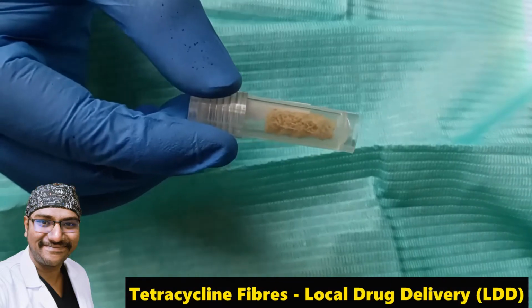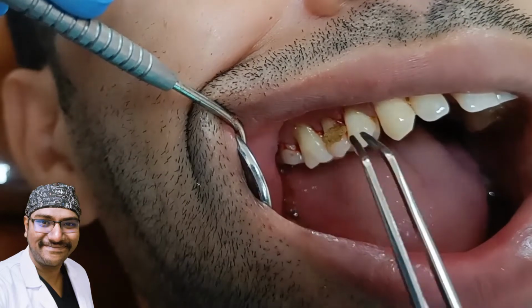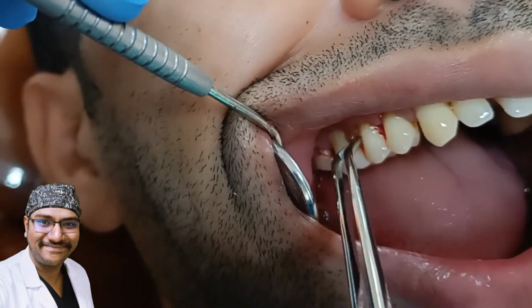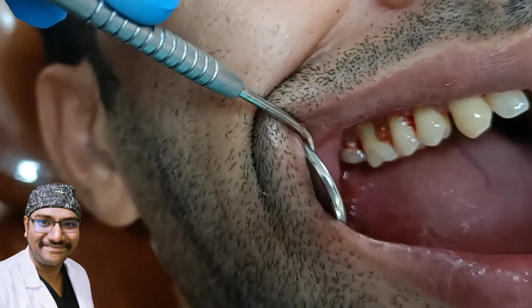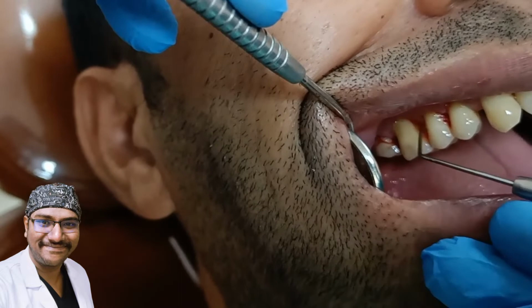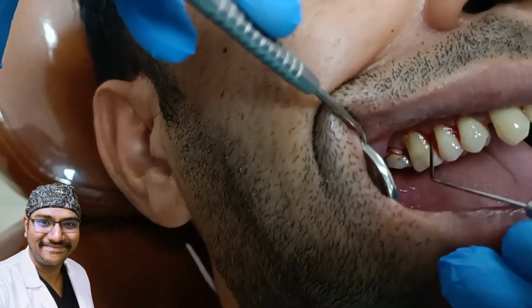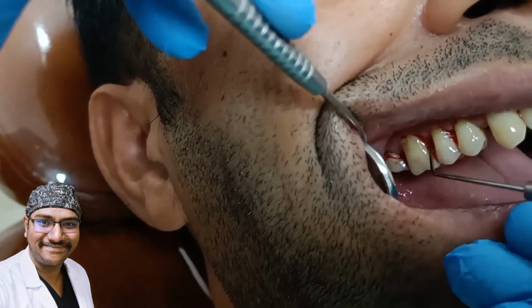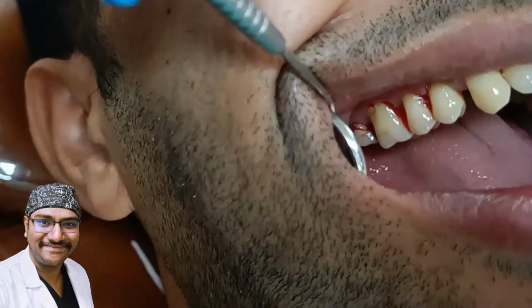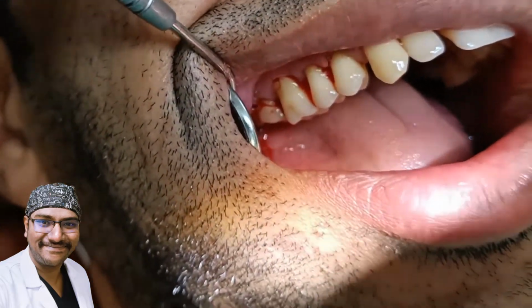Here we can see tetracycline fibers, which are used for local drug delivery. Local drug delivery is a technique which is used in isolated pockets and sometimes in patients who cannot undergo surgical procedure for whatever reasons, and it is done by the direct application of the drug into the pocket with the help of dental instruments, thereby directly releasing the antibiotic into the area where the microbial load is high. So this is all about root planing, curettage and local drug delivery as well as supra and subgingival scaling.